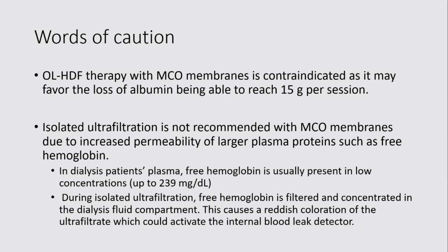So if a patient is on dialysis with MCO membranes, there should not be a programming of isolated ultrafiltration, because there is some loss of free hemoglobin, which is a quite large molecular weight molecule removed by expanded hemodialysis, and it will be read by the blood leak detector in the effluent circuit, and that leads to stoppage of the therapy. So isolated ultrafiltration should not be used.